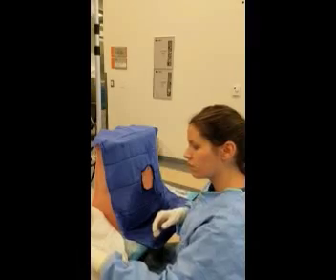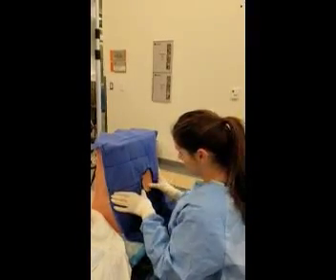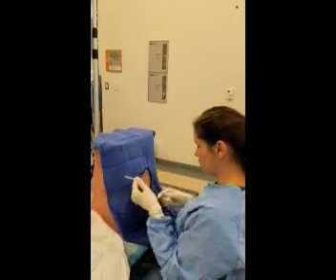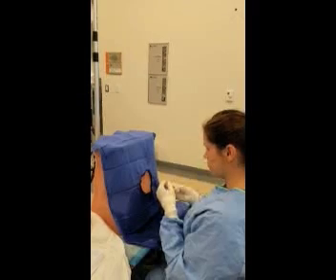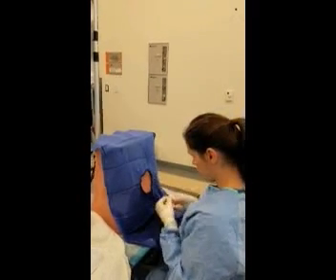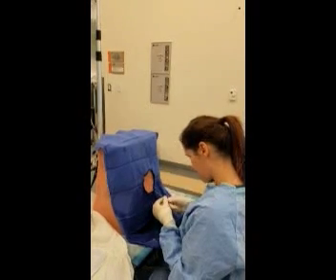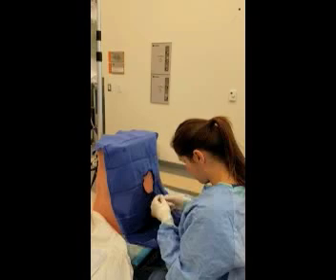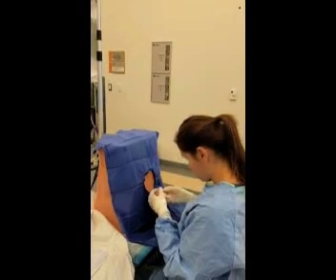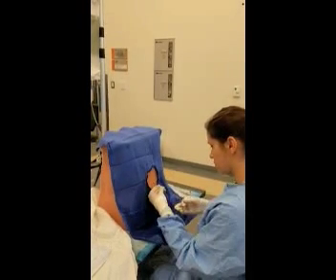While waiting for the area to anesthetize, gather the spinal needle with stylet. Remove the stylet and make sure it smoothly moves in and out. Next, make sure the bevel is toward one hip or the other. The bevel is parallel to the dural fibers, which will separate them instead of cutting them. Next, insert the spinal needle at an angle toward the umbilicus in the clean, marked, and anesthetized area. Insert the needle slowly, advance until you feel a popping sensation, and advancing becomes a little easier there. Stop. Remove the stylet. CSF should flow.